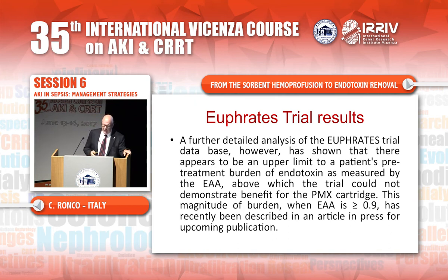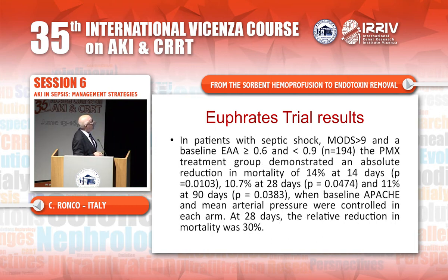And it shows clearly that when endotoxin level is too high, there might be a limitation in the capacity of absorption, but there is also a limitation in the detection because of the exponential correlation between values and concentration, and there is a limited accuracy in the test.